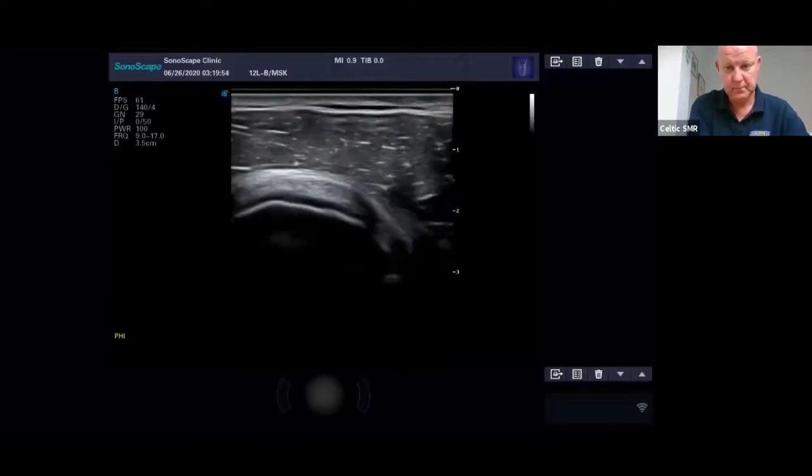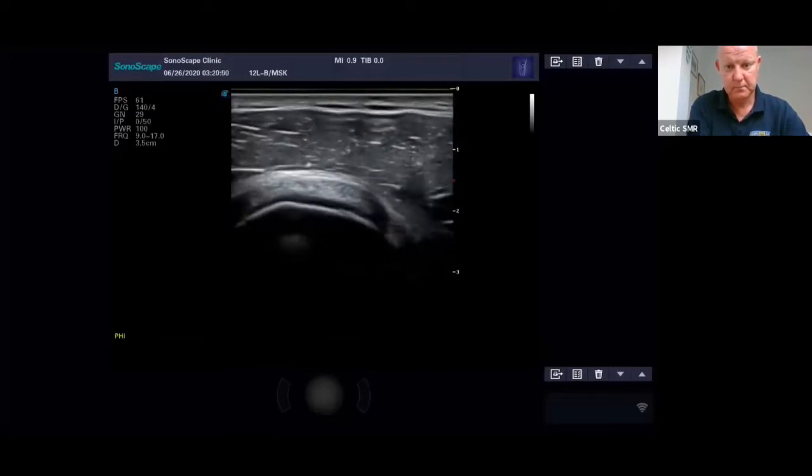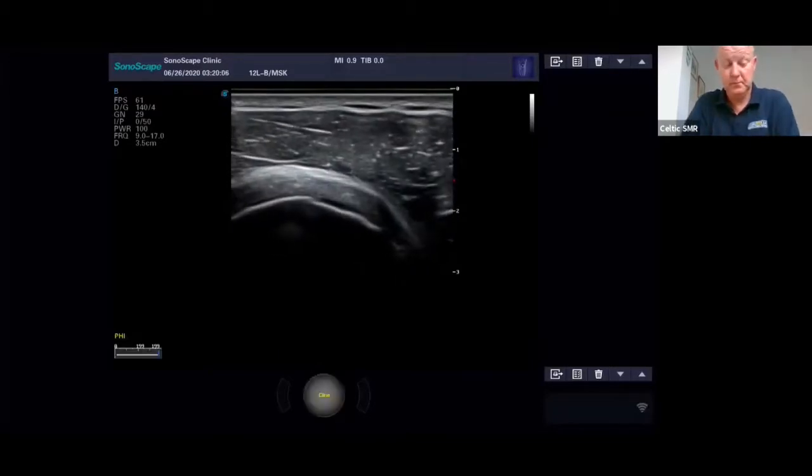So what are the types of tears you can get? You can get a partial thickness tear, a full thickness tear, or obviously a complete rupture. So if you look at the screen here, a partial thickness tear will essentially mean that it's partially going through the tendon, not all the way through. So it could be like a dark defect through here. So we might be looking at a small partial thickness tear through here.